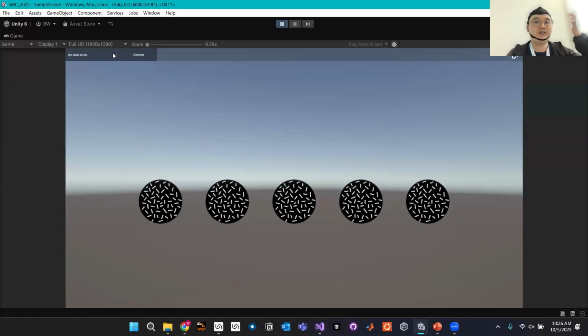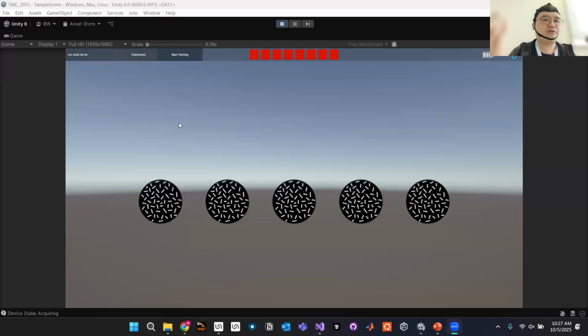Because in the upcoming 24 hours, you're going to work in teams, and not everybody will have the same devices with you. And if you don't have a device, but you still want to contribute, then you can use a simulator instead. And then the next step would be to have the connections, and it is already done.